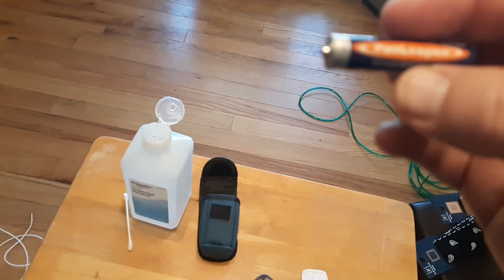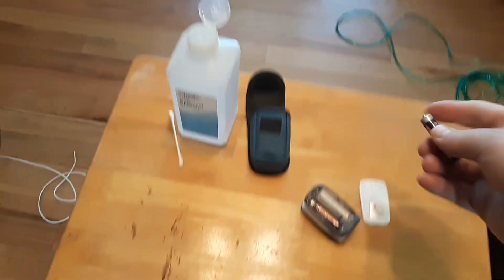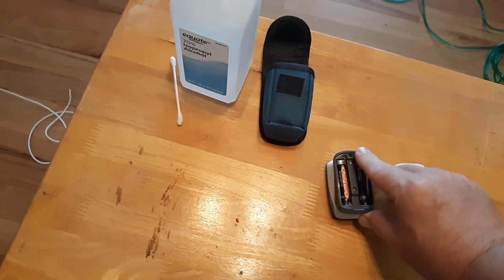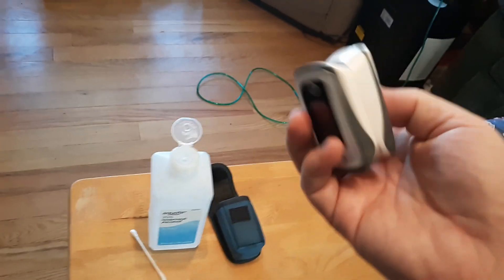So you can see there it's triple A batteries and they'll usually require two of them. Make sure you put in fresh triple A batteries, or whatever batteries your oximeter uses, because that's usually the problem — the batteries run out.